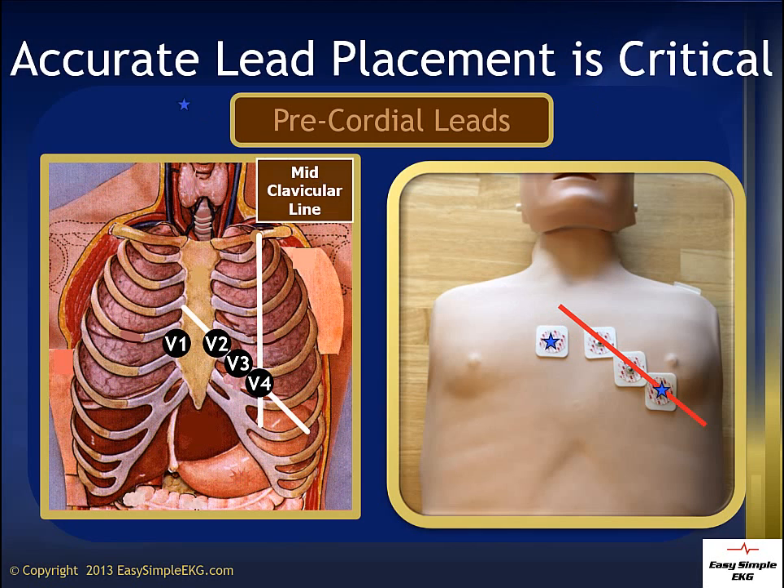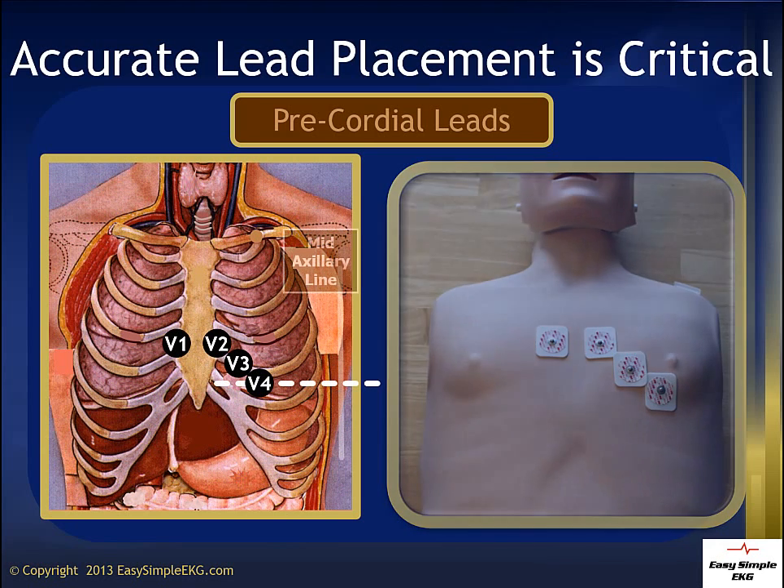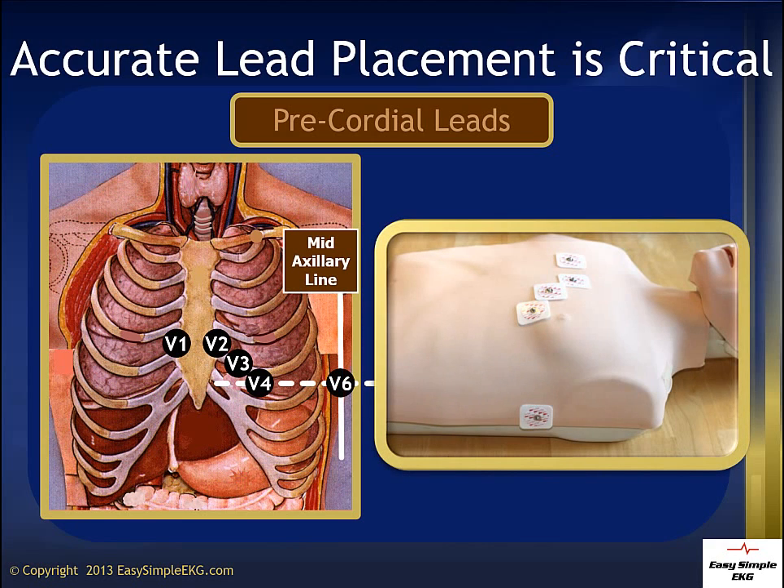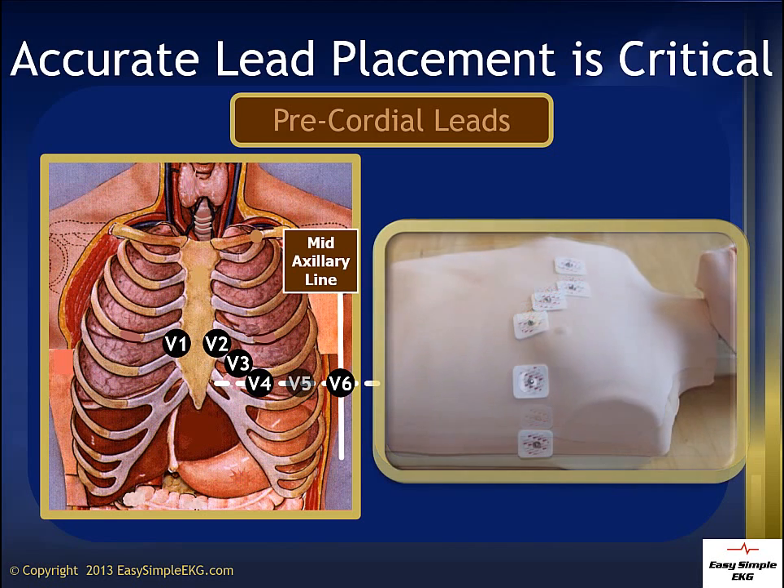V6 is the next lead placed — skip V5 for a moment. V6 should be placed on the far left side of the patient at the same level as V4, at the mid-axillary line. Many people are surprised with how far to the side V6 is placed. Lead V6 is looking at the left side of the heart, so make sure it is placed correctly. V5 is finally placed at the same level as V4 and V6, equidistant between the two other leads.